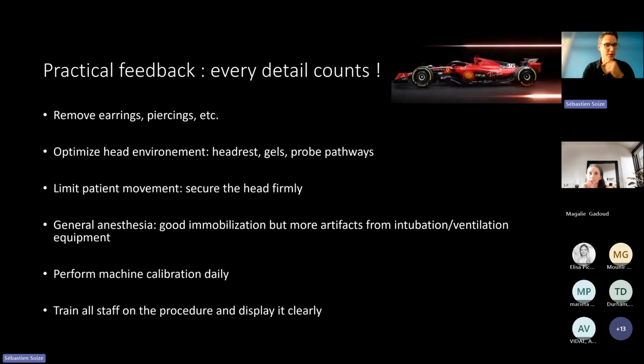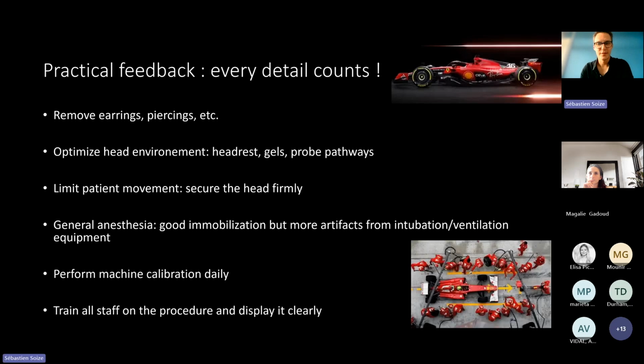Also, you have to train your team, like the Ferrari team or every Formula One team, to remove every metal around the head of the patient, optimize all the head environment, the headrest, gels, remove every probe from the field of view, try to secure the head, attach it firmly, and also be aware that with general anesthesia you have plenty of tubes, and sometimes it can create artifacts.